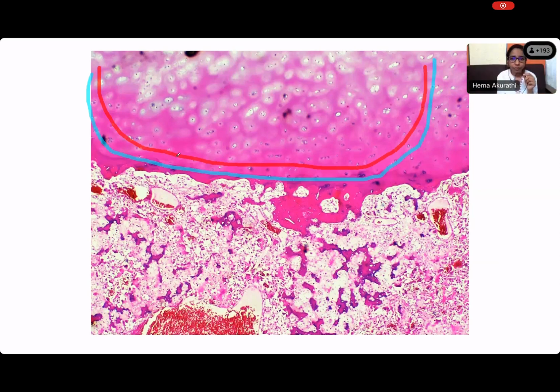You agree with Sarangi that this is cartilage. Now, what cartilage is this? Part of the tumor, ma'am. Part of the tumor. All right. So you are on Sarangi's slide. Now we come to Zara, before I get to Prayas.